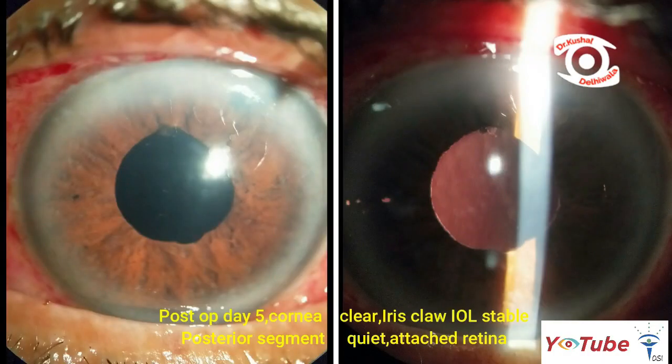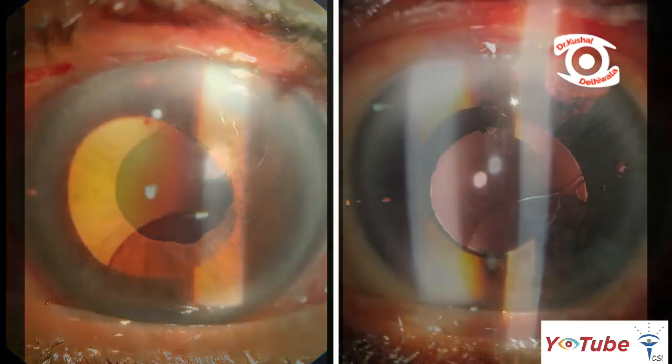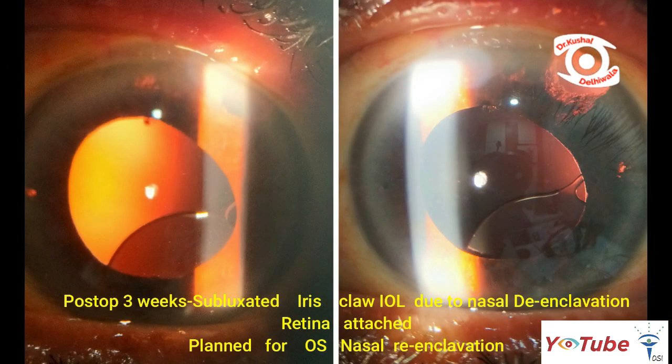At post-op day 5, the eye was quiet with a stable and well-centered iris claw lens. However, at 3 weeks, temporal subluxation of the lens was noted due to nasal de-inclavation. Hence, left eye iris claw lens refixation was planned.